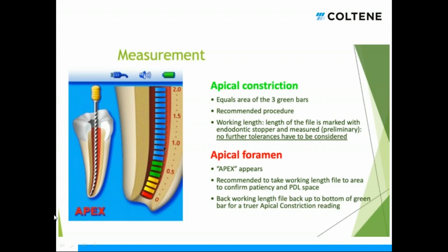Yeah, back to what we were saying about what Kuda was talking about, being a millimeter shy of the apical foramen. That's all the way up in the blue. And I think that green area, known as the apical constriction, is a pretty good rule of thumb.